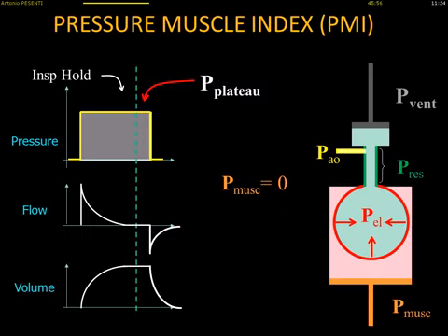This is called pressure muscle index. It is an index that Dr. Foti invented some 15 years ago. And it's very simple, but often very effective.